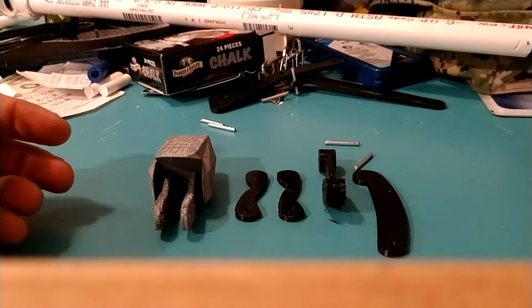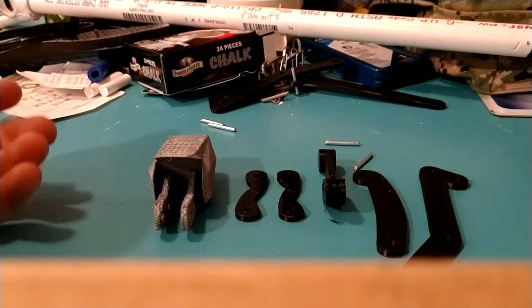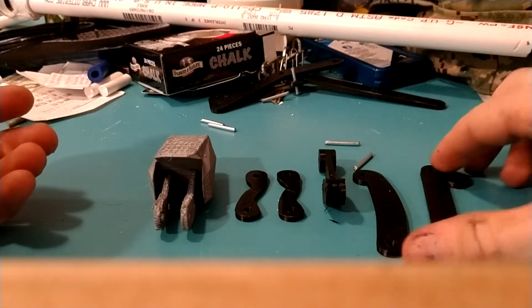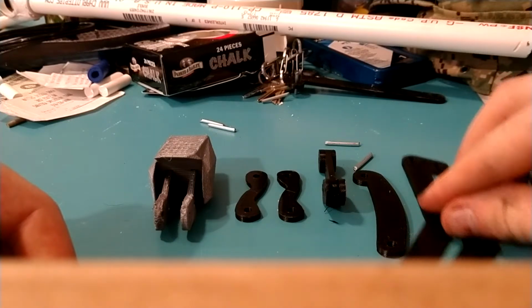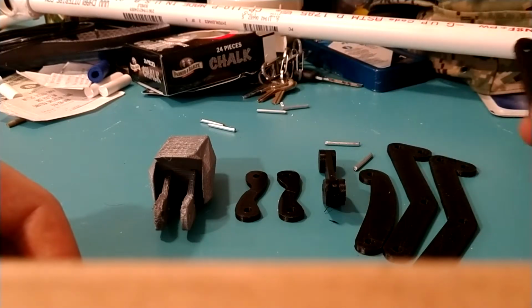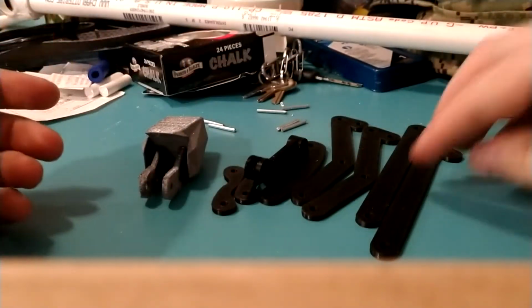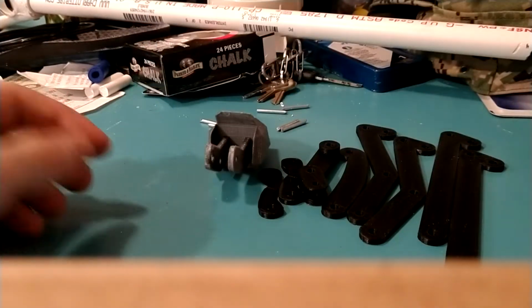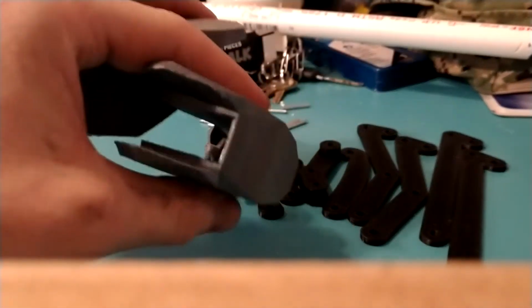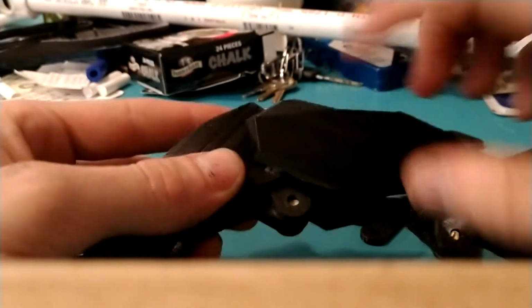It's the mid-finger extender. And then these are the base finger bars. You're going to need 2 of them. And then I believe I called these the control bars. And you're going to need 2 of these as well. So all in all, you're going to need 1, 2, 3, 4, 5, 6, 7, 8, 9 parts, not including the 2 back plates. This back plate, right?